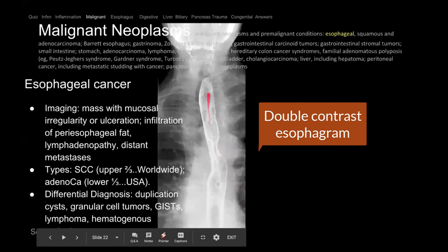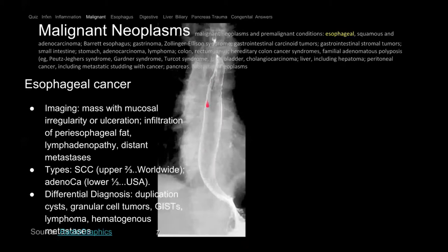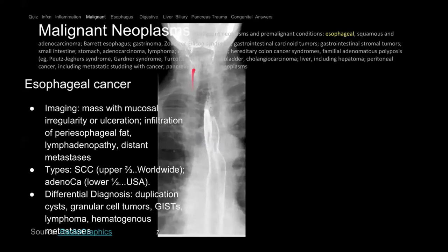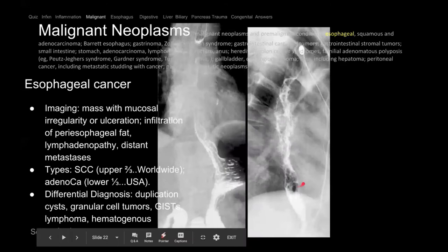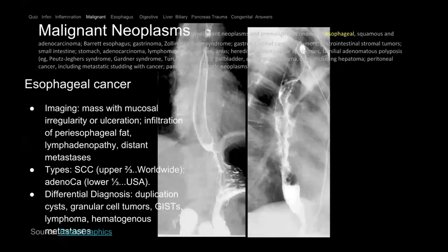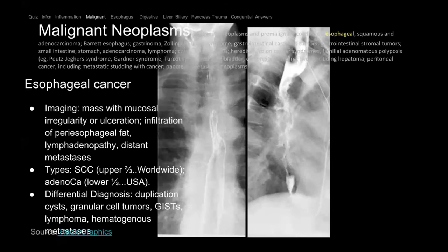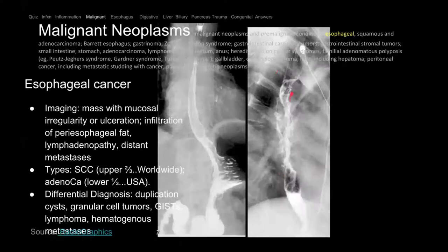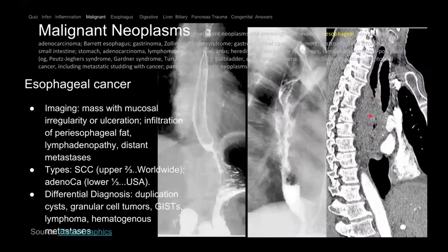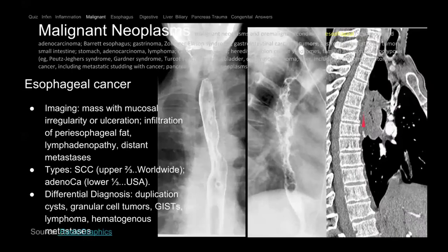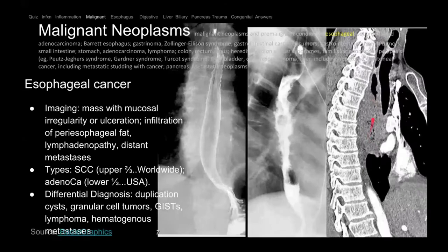This is a double contrast study — the patient has bubbly air like Alka-Seltzer, plus contrast — so it's double contrast showing air and contrast. This is a normal esophagram. But this one is abnormal — there's slow movement of fluid and filling defects along the wall, it's irregular. This CT scan of the same patient shows esophageal cancer — there's a mass that looks webby because of ulceration and invasion.